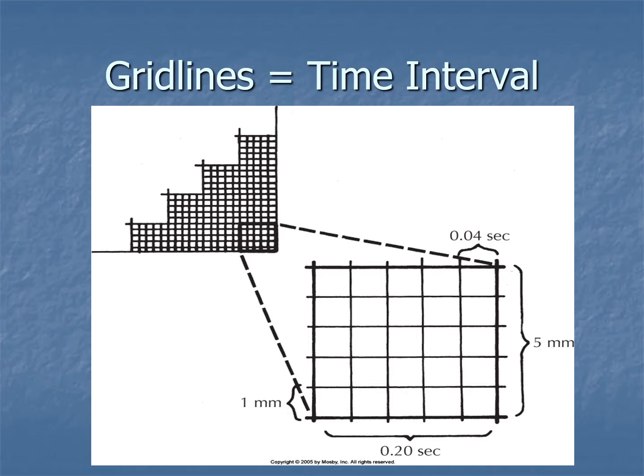But I know that when I recently took the ACCS exam, and for you nurses out there, it's the Adult Critical Care Specialty for Respiratory Therapists, there was definitely fairly heavy emphasis on EKGs, just as there are in ACLS. And I think there was actually one question where they wanted you to be able to calculate the actual rate, the heart rate, based on a rhythm strip. And I know in ACLS they want you to do this as well.